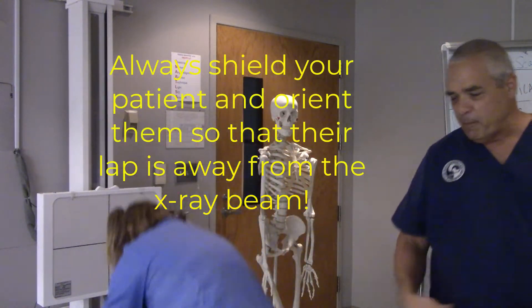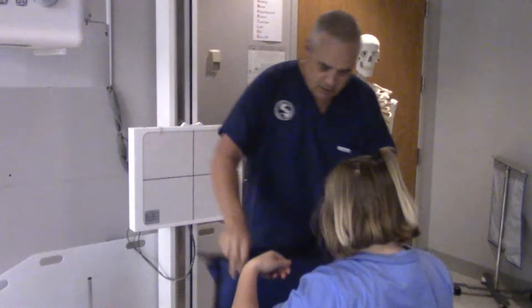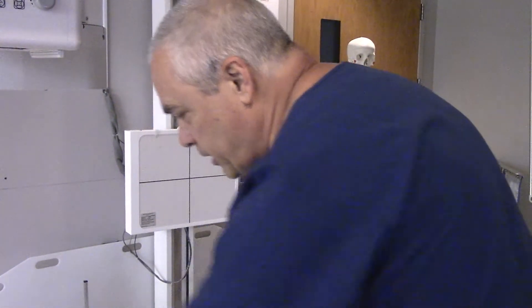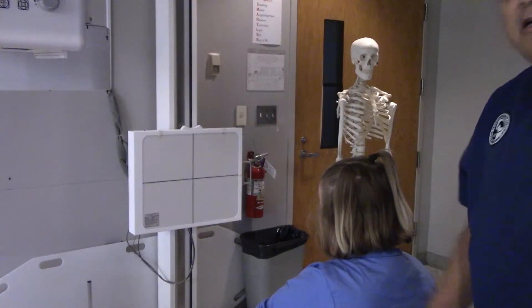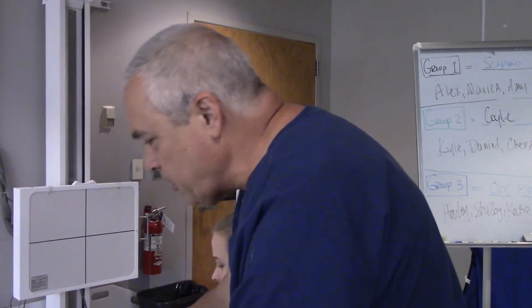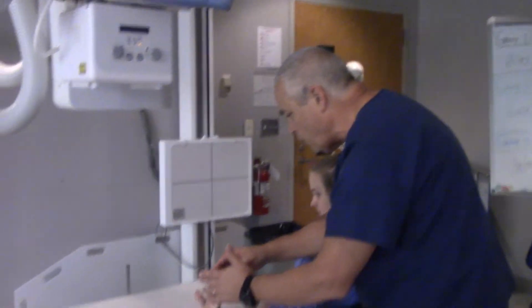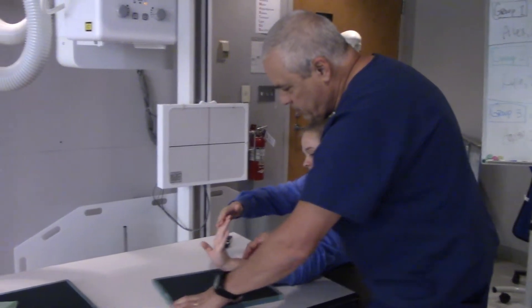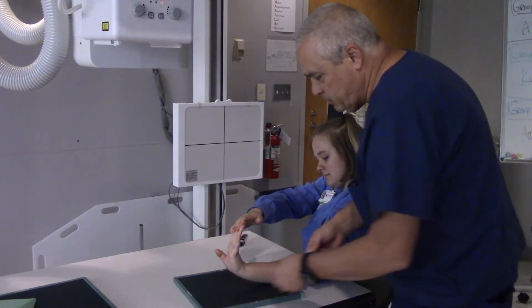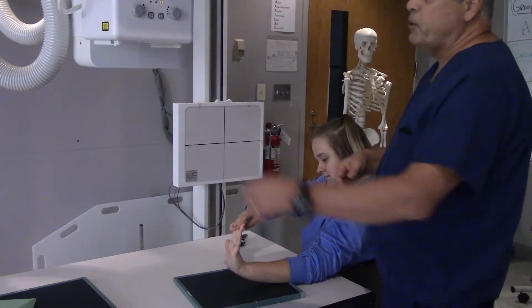I'm going to have my patient sit down in this chair. First things first — shield. We're going to go ahead and put a shield on. Now, this young lady has hurt her wrist and needs an x-ray of the carpal tunnel. If you could just extend your arm out for me — I need you to pull your fingers back like this. Can you hold those with your hand? Outstanding. Now I'm going to center up my image receptor. This is her left hand, so we'll go ahead and put the left marker on, marked laterally as we're supposed to.